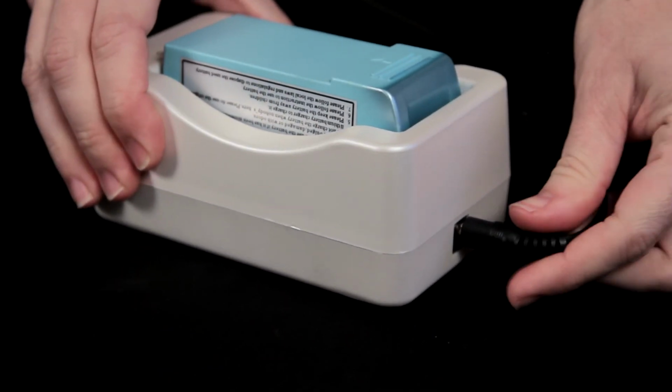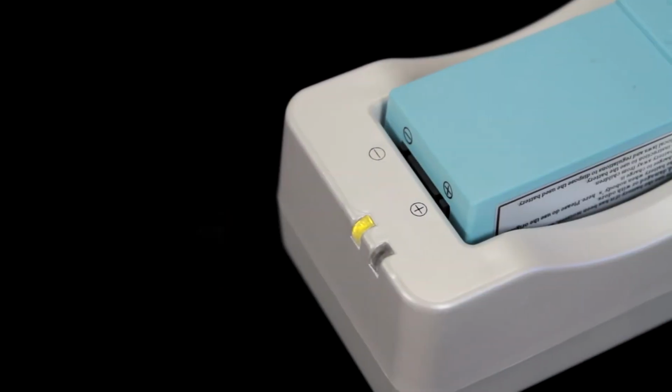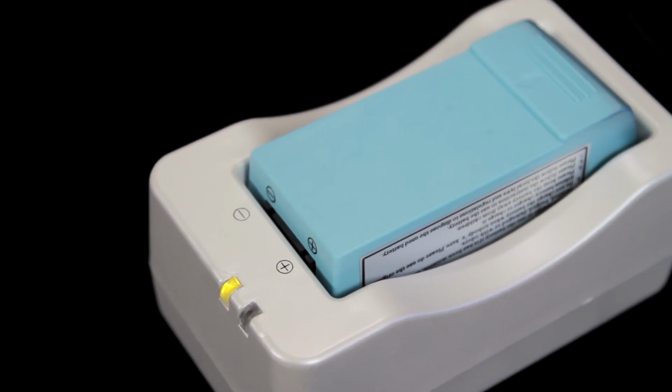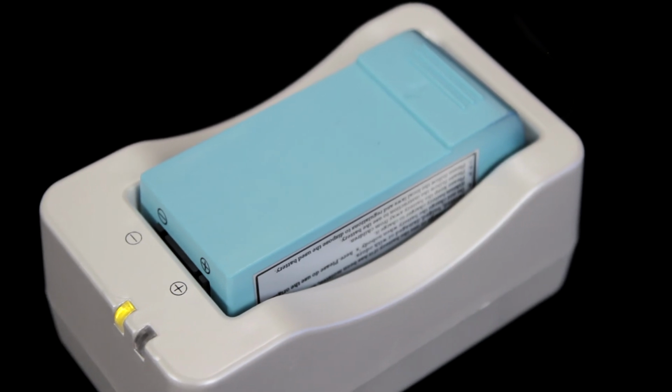Disconnect the power between the power supply and charger before removing the battery. It is important to never leave the charger unsupervised while the battery is charging. Do not place the battery, adapter, or charger near fire, heat, flammable, and explosive materials.